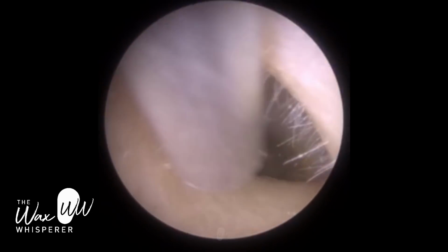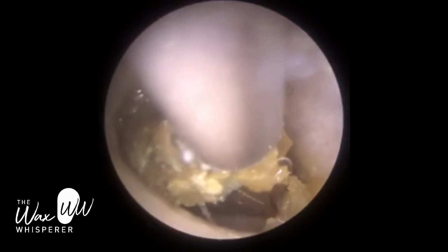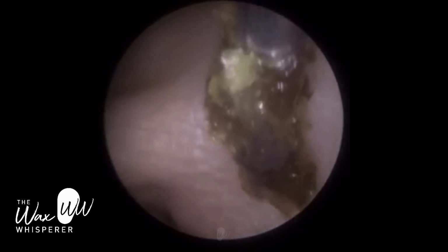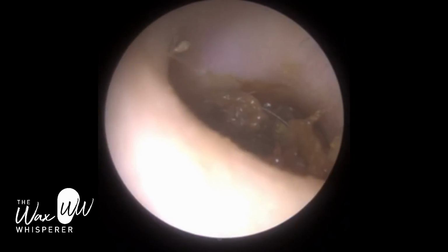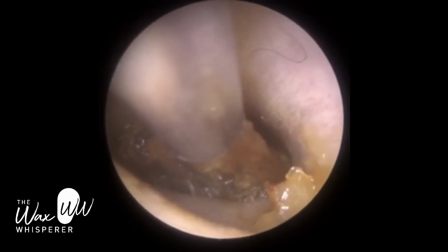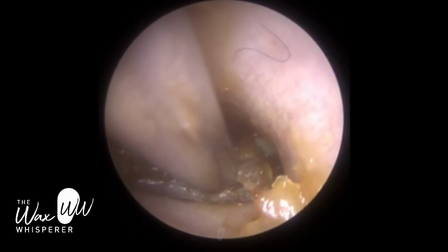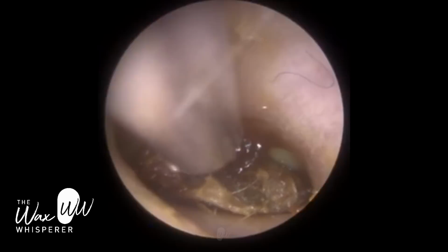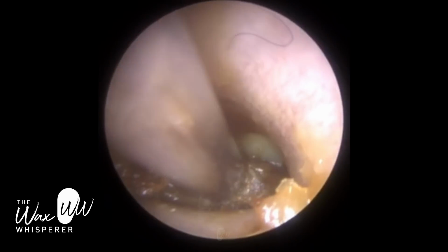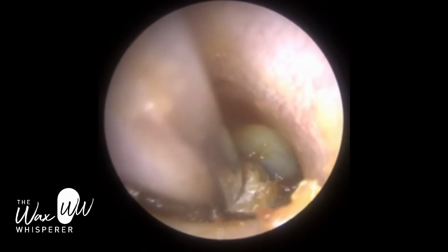So this is the patient's left ear, and you can see the wax is a bit more glutinous. So it would imply that it's a bit more wet. It looks a bit more wet, but it's a false wetness. This is not the natural consistency of the patient's earwax. The patient advised me that their left ear was the worst one, and they've been putting drops in this ear at night when they're in bed, laying down. And I believe it to be because the patient had been using drops in this left ear that this earwax looks wet. If the patient had the ceruminous glands, then you would expect the earwax in the right ear to be automatically wet, but it wasn't, that was dry.